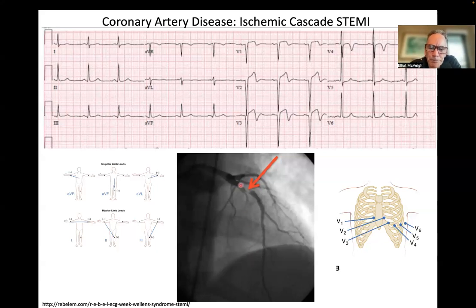Because it certainly seems to be a weak point in our survival. So anyway, this lesion here caused ischemia down here, which is causing this strange ST complex here, right? So this is the QRS. And we're out to the T wave, and you can see that there's a very large voltage that is changing over time as we're moving towards the repolarization of the heart. And so this signal right here, you don't have to be an expert to read it. You can call that.